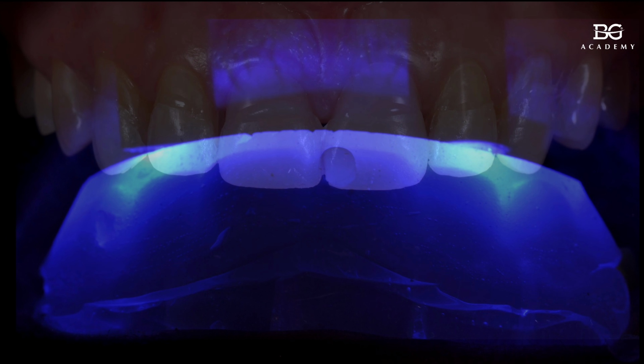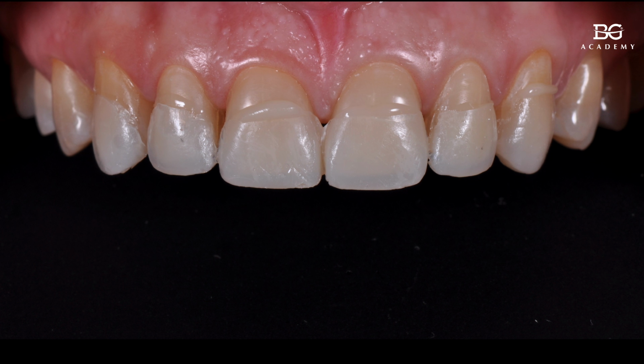Okay, so we do spot etch, we do spot bond, curing, and then you fill your silicone index with composite, any shade as I mentioned. You place it, you cure it, and you have almost 75% of the temporary restorations done, as you can see here.